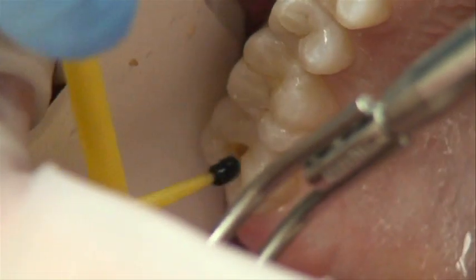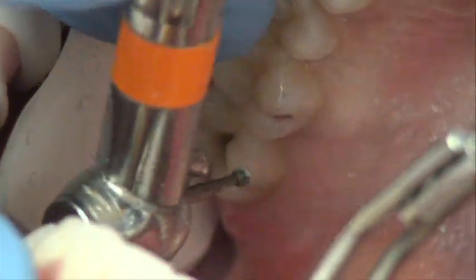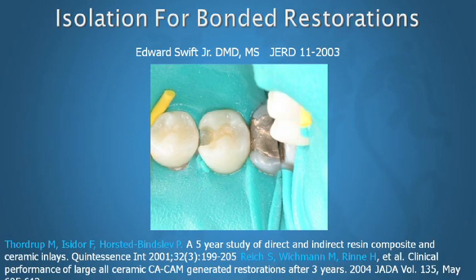So right here we see the use of the caries detector. Don't leave it for very long, because if you leave the caries detector on a tooth for a long time, it's going to stain everything anyway. So it should be applied and rinsed quickly.